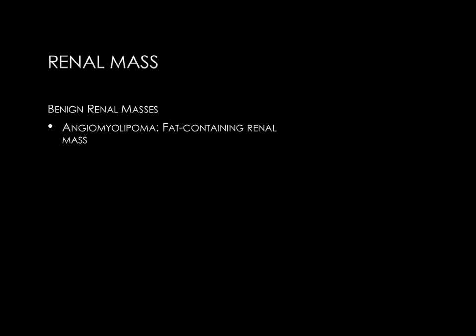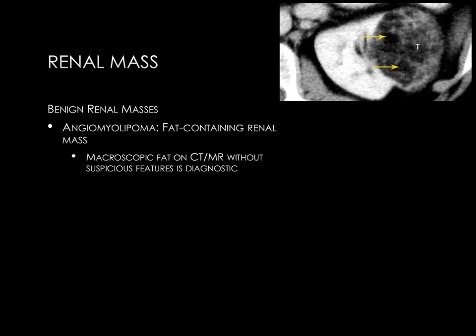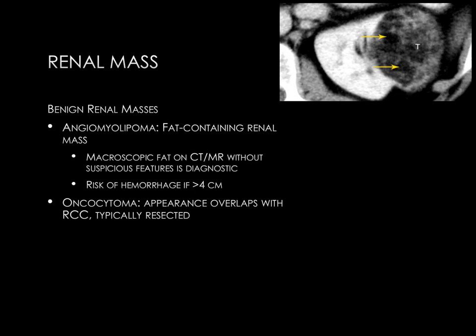Next we'll discuss some benign renal masses with typical imaging features. A renal angiomyolipoma is a fat-containing benign renal mass, diagnosed by identifying a mass with macroscopic fat on CT or MRI with no other suspicious features. The CT image demonstrates an exophytic left renal mass with multiple areas of low density measuring approximately minus 40 Hounsfield units, typical of macroscopic fat — classic for renal angiomyolipoma. While benign, if these lesions are larger than 4 centimeters there is a risk of hemorrhage due to abnormal blood vessels, and these patients should be referred to interventional radiology for embolization.